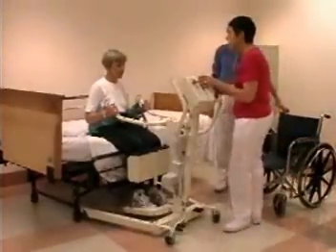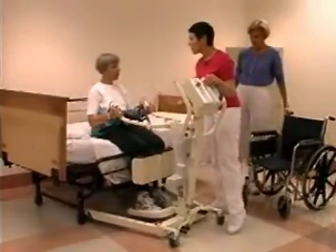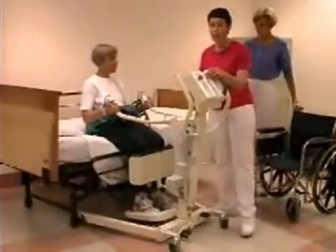Okay. Mrs. Johnson, I'd like you to lean back slightly while we do the lift. That's perfect. And that's going to keep you right in the spot where you should be in the sling.